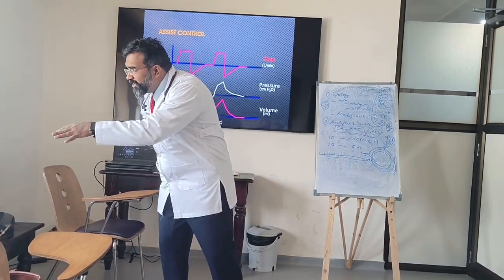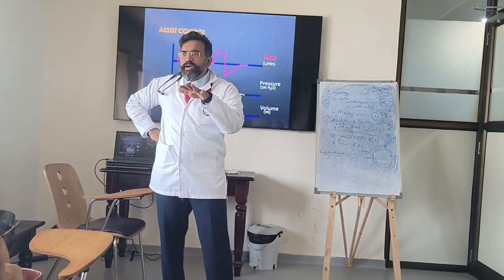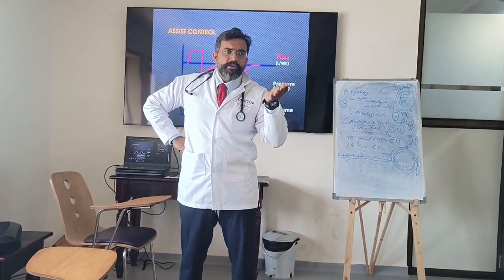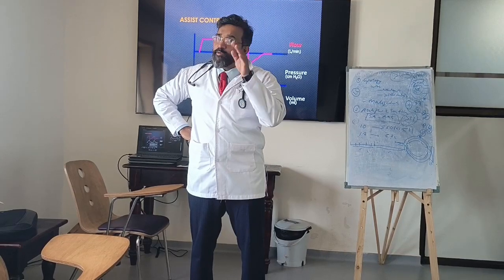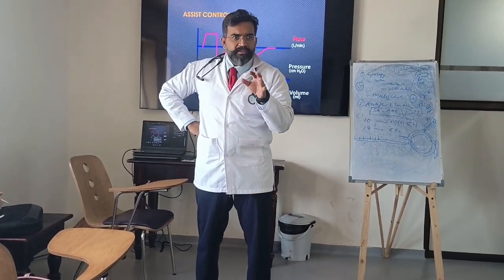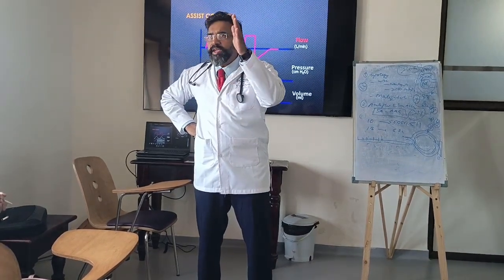It will assist each breath. You understand? If I breathe fast, it will assist each breath. This can be problematic. So if the patient has got fever, the patient will breathe faster, say a respiratory rate of 40. If he breathes 40, he will get 40 breaths of 400. What you have said. Are you understanding? So it can go into extreme respiratory alkalosis.